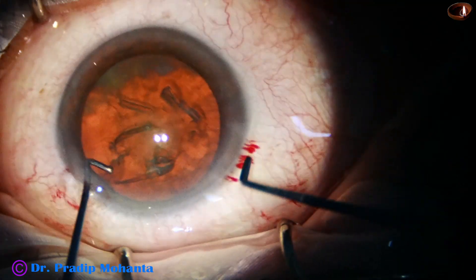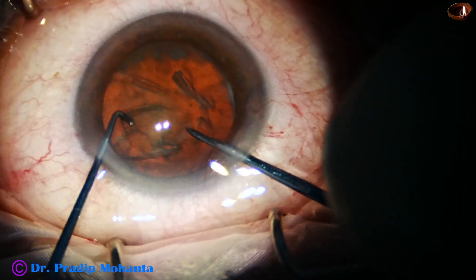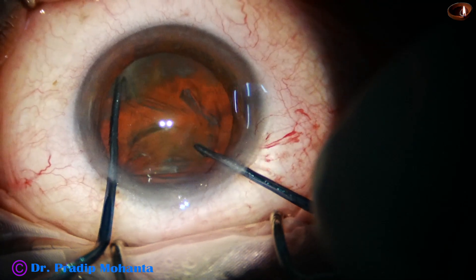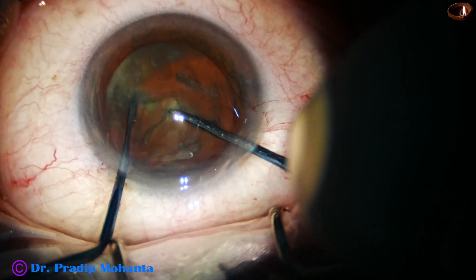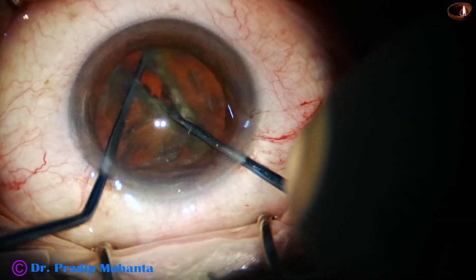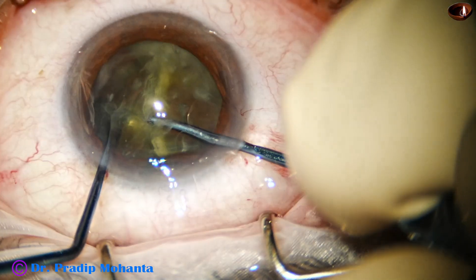Here goes the pre-chopper designed by me, and in the left hand is the nucleus sustainer, which is also designed by me. Here goes the pre-chopper. The nucleus sustainer supports the opposite side of the nucleus.